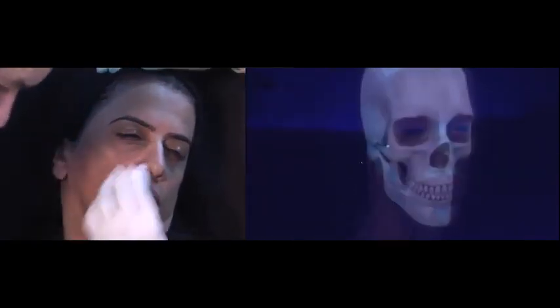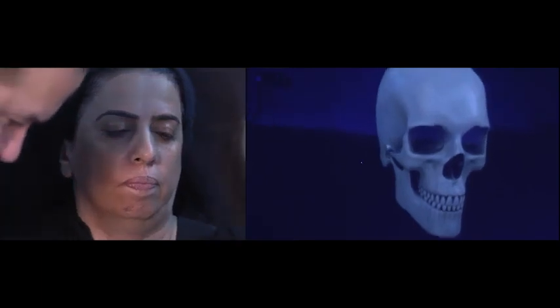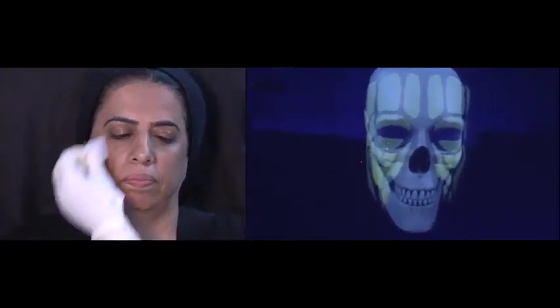So I'm going to do a double layer treatment, okay? Frank, could we see the relationship between the deep and superficial fat pads in the cheeks? Okay, so I will take the skin first out and I will take the muscle out. So you have here the deep fat pads, and now I'm going to put the superficial. And as I move it, you have to slow down, Frank, because there is a lag in the signal.